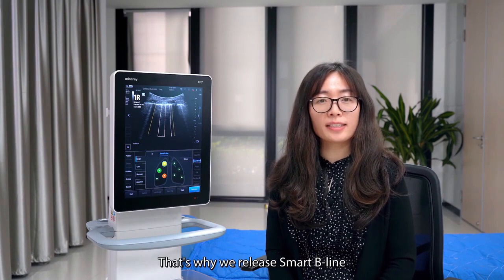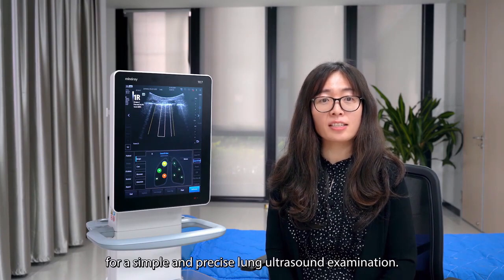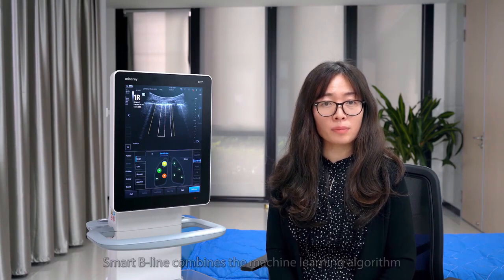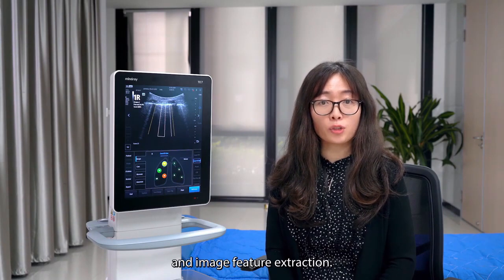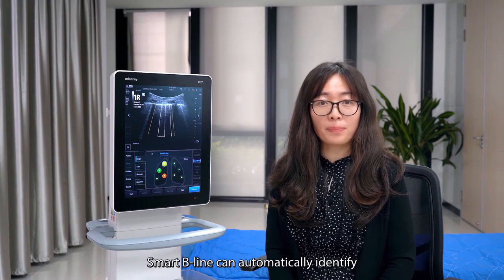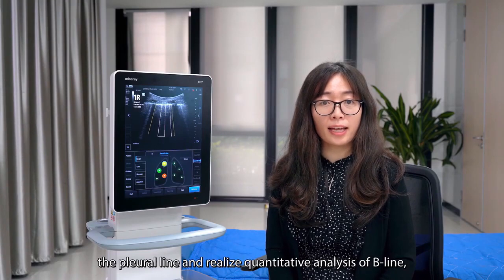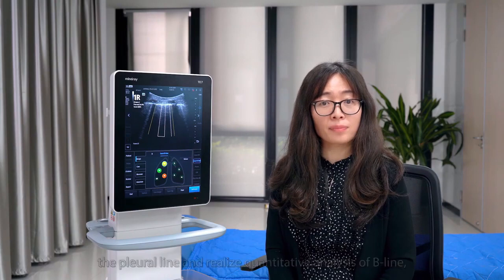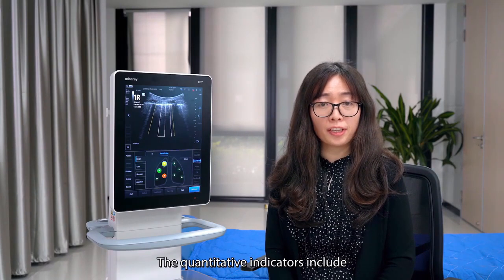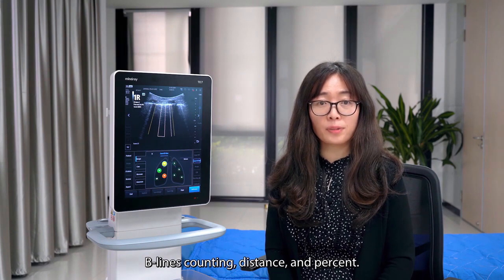That's why we release Smart B-line for a simple and precise lung ultrasound examination. Smart B-line combines machine learning algorithms and image feature extraction based on clinical big data. It can automatically identify the pleural line and realize quantitative analysis of B-lines, providing line scores. The quantitative indicators include B-line counting, distance, and percent.